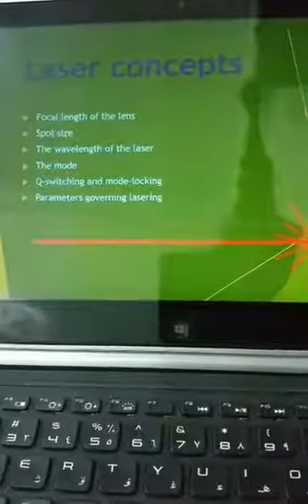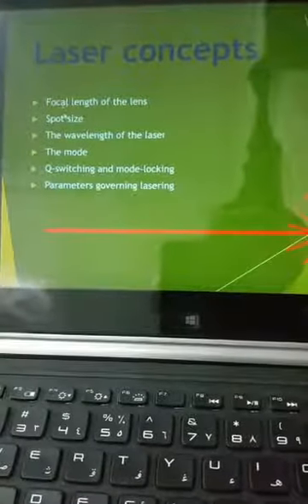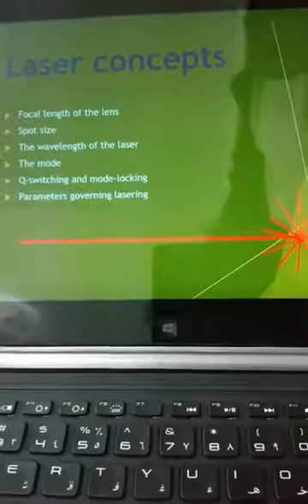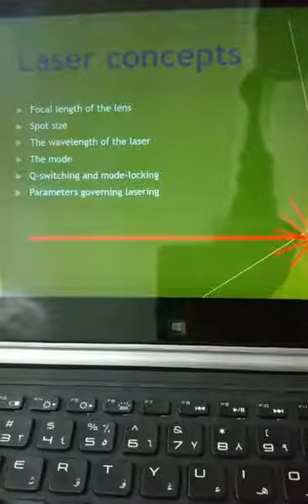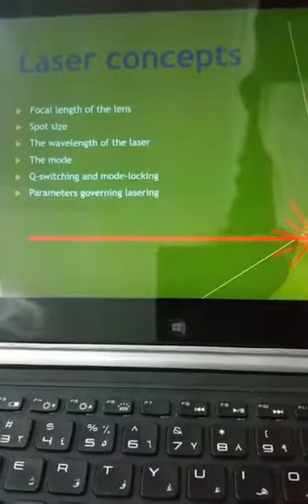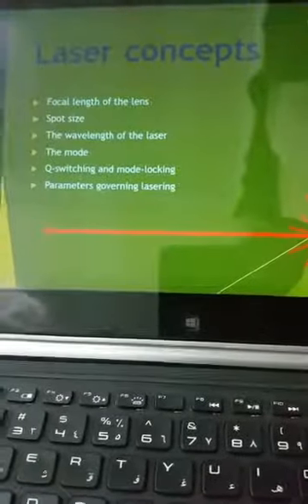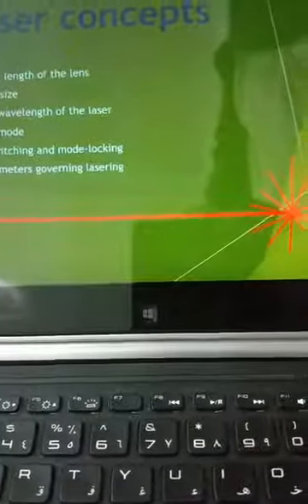I don't think it's important to talk about this, but it is very important to know, if you're applying laser, the spot size. What is the energy density? How much energy do I need to apply for a specific lesion? And I have to, of course, know the parameters covering soft tissue, like retraction, or how fast I should run the laser with my hand, and how much power I need to use. Do I need to use 20 watt or 10 watt or 1 watt?